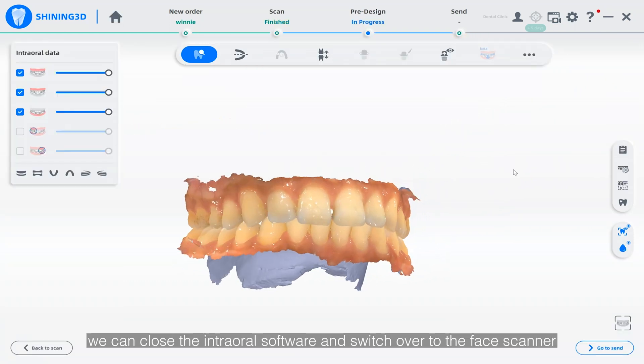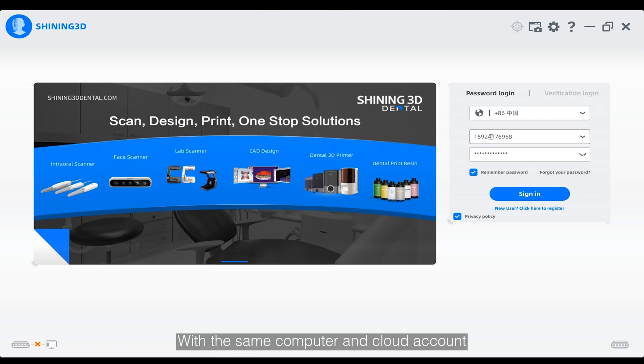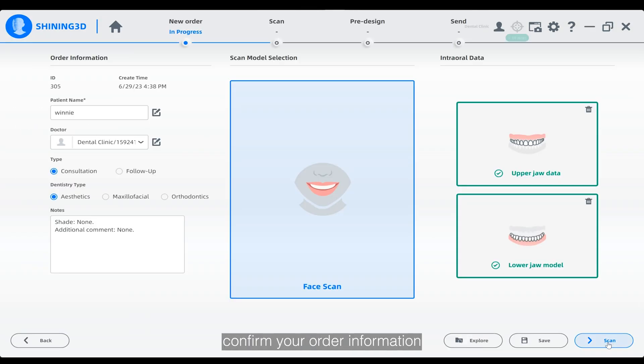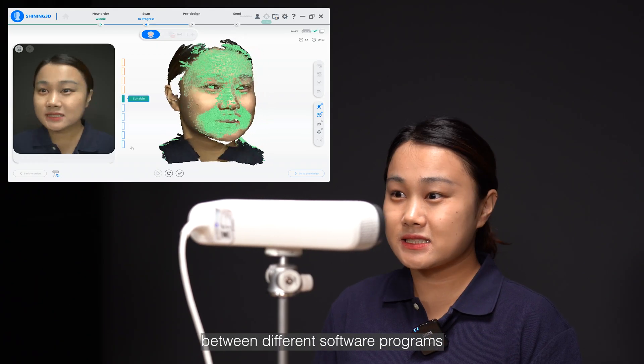Once we are done, we can close the intraoral scanner software and switch over to the face scanner. With the same computer and cloud account, you will find the intraoral scan data we captured earlier on the homepage of the Matti Smile face scanner software. Simply double-click on this scanning case, confirm your order information, and start scanning directly. This streamlined workflow eliminates the need to transfer data between different software programs.